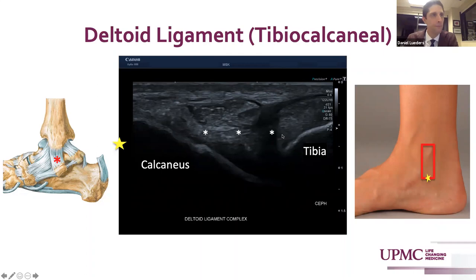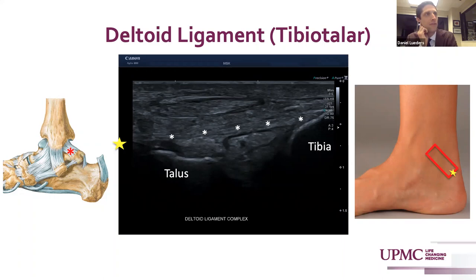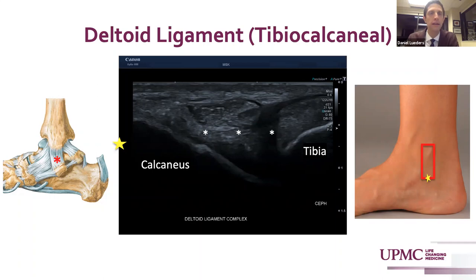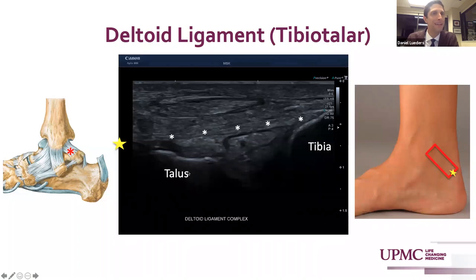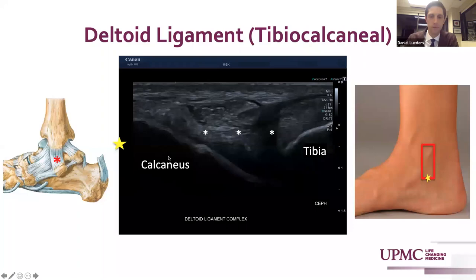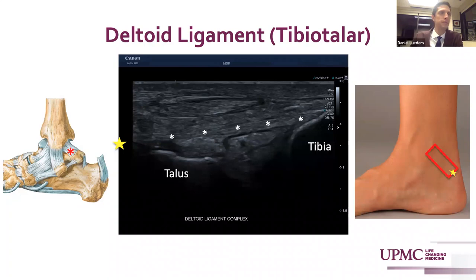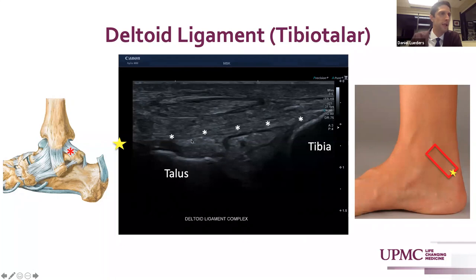The three contributions to the deltoid ligament are the tibionavicular, tibiocalcaneal, and tibiotalar. The tibionavicular component bridges from the navicular tuberosity to the anterior tibia and is clearly visualized as a laminar hyperechoic fibrillar structure. Keeping the probe anchored on the inferior medial malleolus and performing a fan-like sweep posteriorly, you'll fall off of navicular and come to calcaneus to get to the tibiocalcaneal contribution. This sits deep to the posterior tibial tendon, so the refraction shadow can make the tibiocalcaneal fibers less distinct, but here we see that ligament indicated by the asterisks bridging from calcaneus to tibia. The tibiotalar is the longest and most distinct fiber, visualized by rotating the transducer so that calcaneus falls off and we get to the talus — that hyperechoic fibrillar structure bridging across.